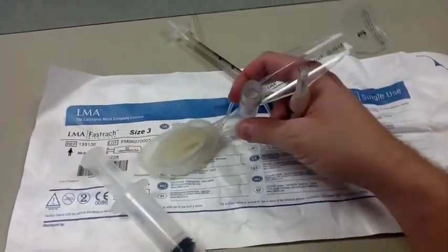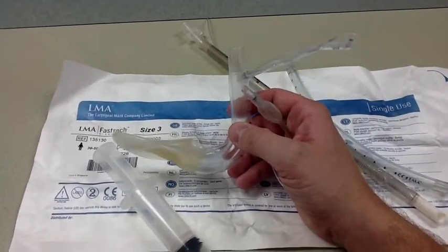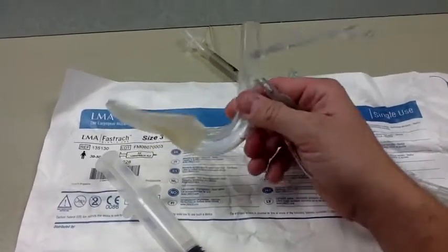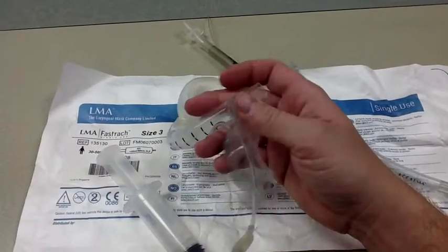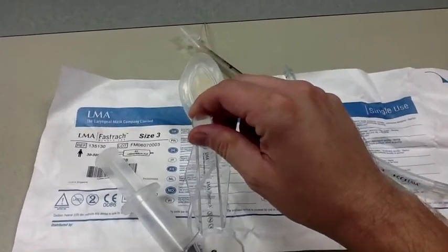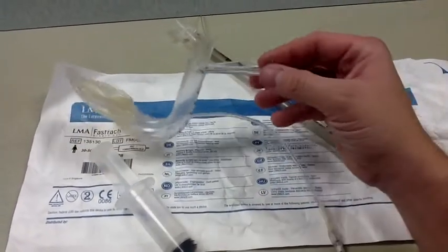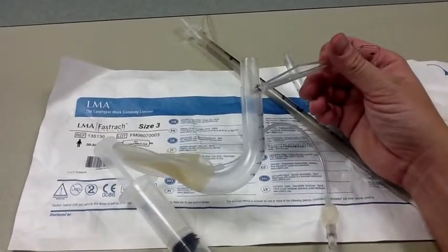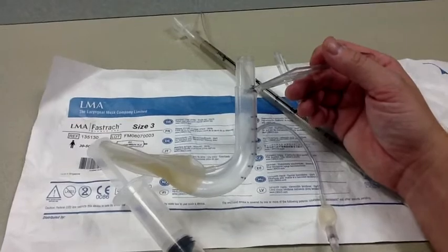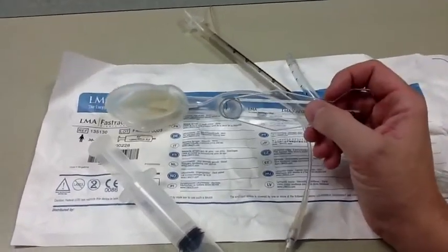It is inserted in a similar fashion to the original LMA — I'll do a demonstration in just a little bit. Once inserted, you go ahead and ventilate by attaching your bag to the distal portion of the LMA, and you assess for proper placement using the typical means: carbon dioxide detection, lung sounds, chest rise, pulse oximetry, color, and so on.